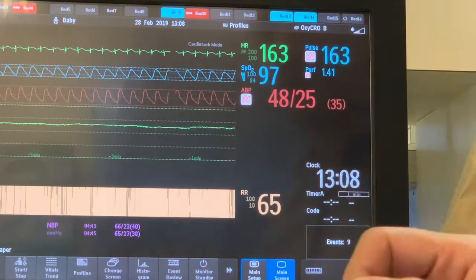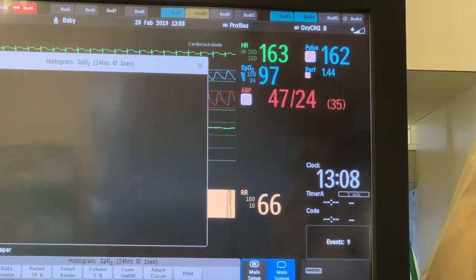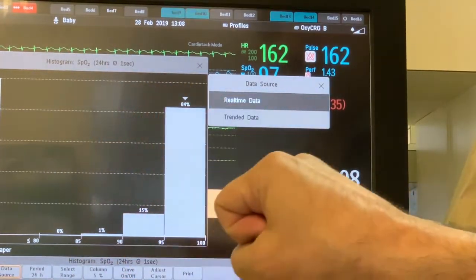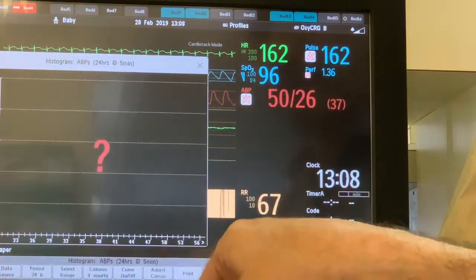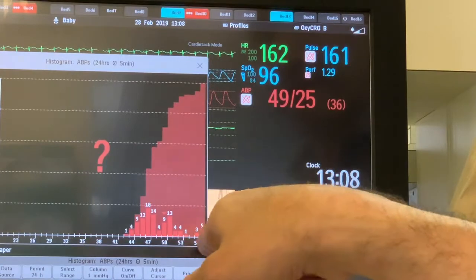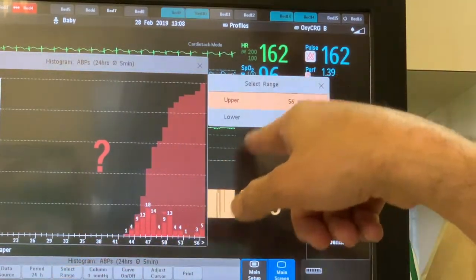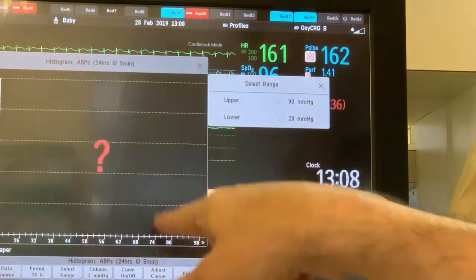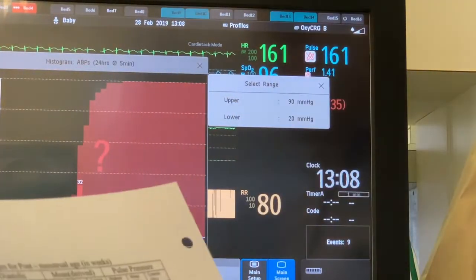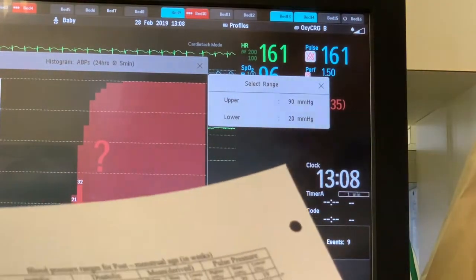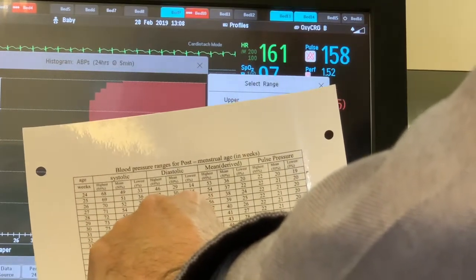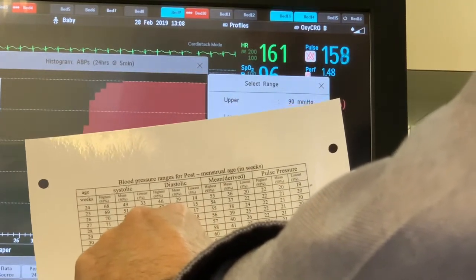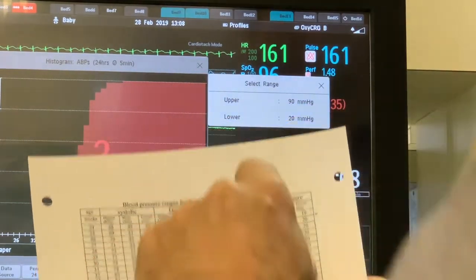You can get a cumulative idea for the last 24 hours by going to histograms. By default, you have the option for the last 24 hours. Select systolic blood pressure. If it's exceeding the upper limit shown, select the range and make the upper limit higher, like 90 mmHg. For this infant, for example at 28 weeks, the acceptable systolic blood pressure is between approximately 40 and 55 mmHg — so the lowest acceptable systolic is 40 mmHg.